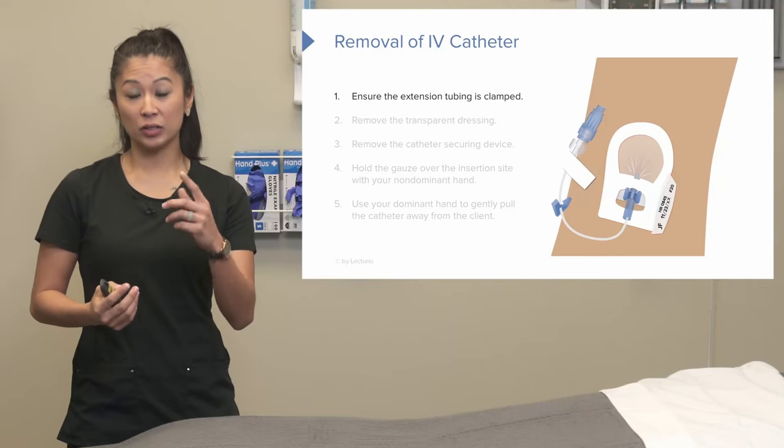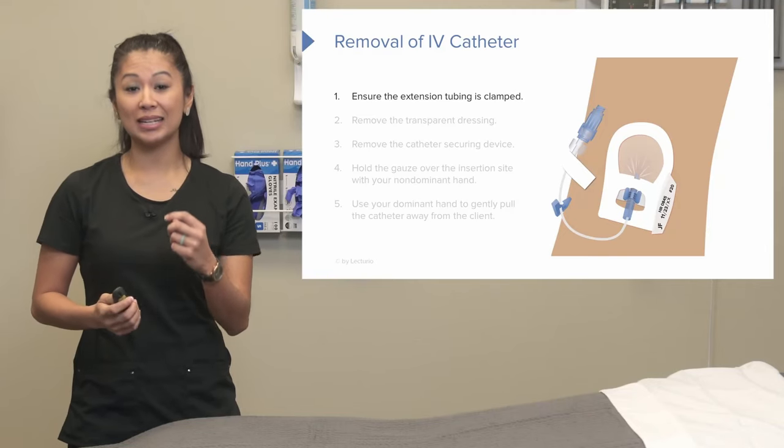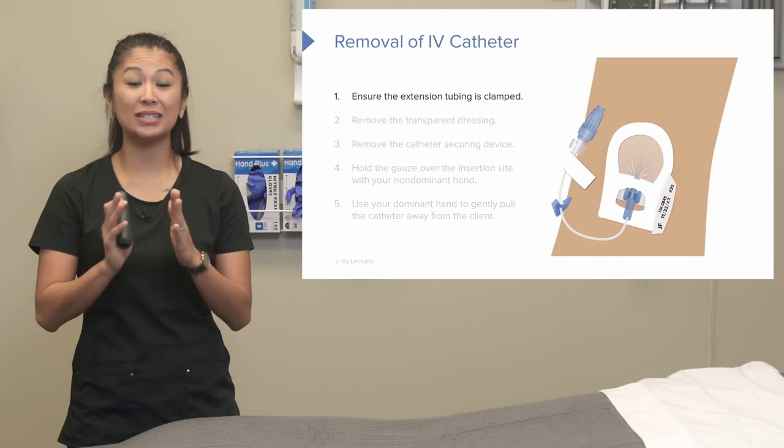Before we remove the catheter, there's a little slide clamp on the extension tubing and we want to make sure this is closed and clamped off.